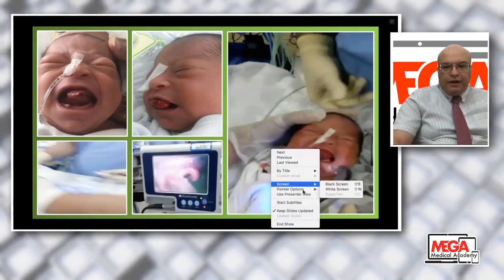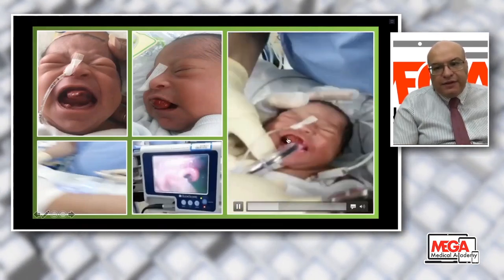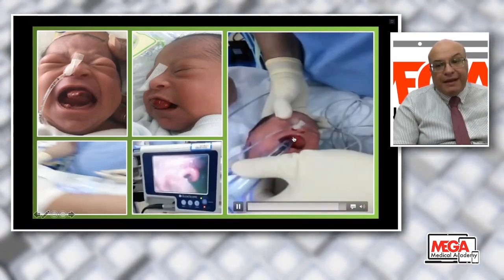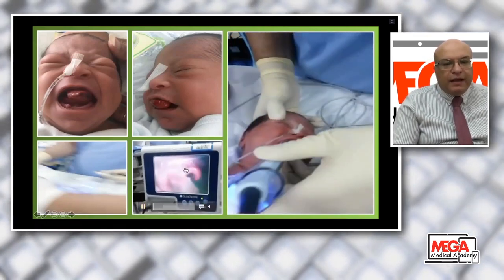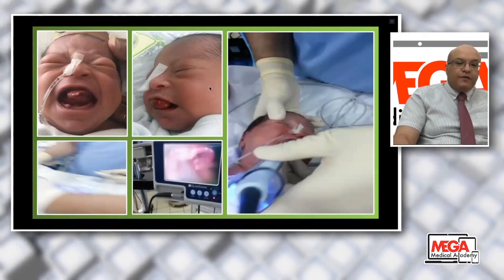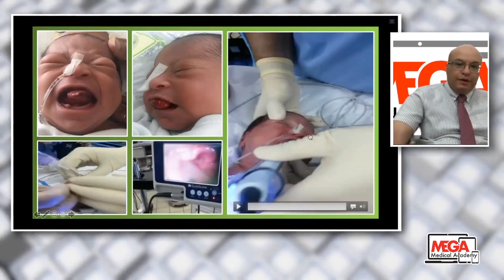If we take a look here at this video, you can see we did awake intubation. You can see the glidoscope is inserted beneath the mass and above the tongue. So the mass up here is the mass, it is not the tongue. And with glidoscopic guidance, we advanced the tube into the glottis with some navigation to facilitate passing of the tube. And here the patient is awake after intubation using a glidoscope.